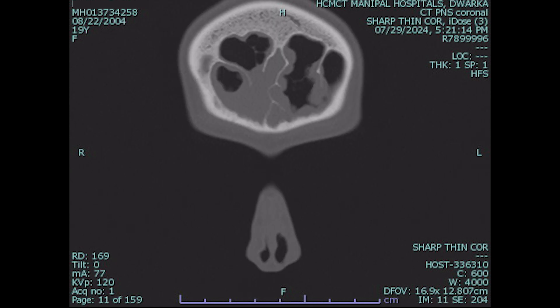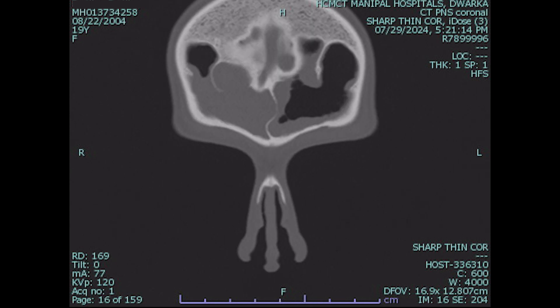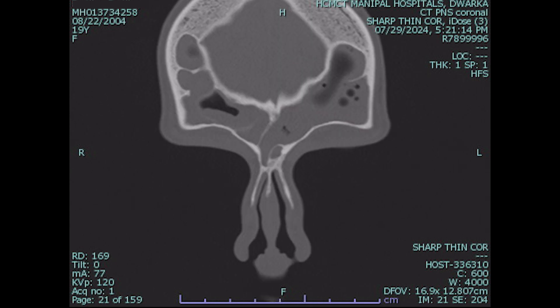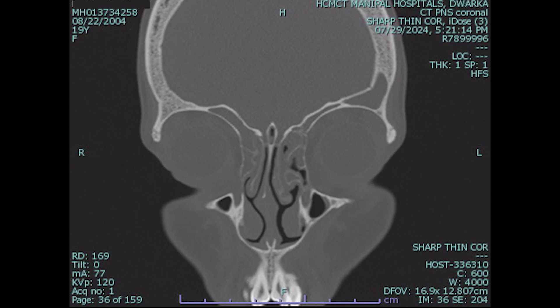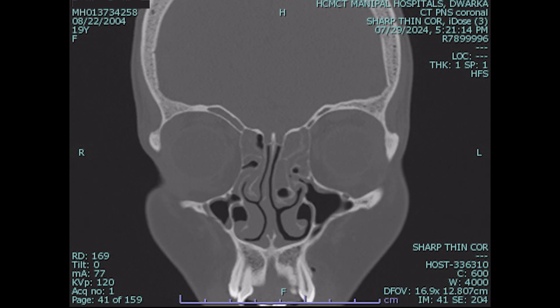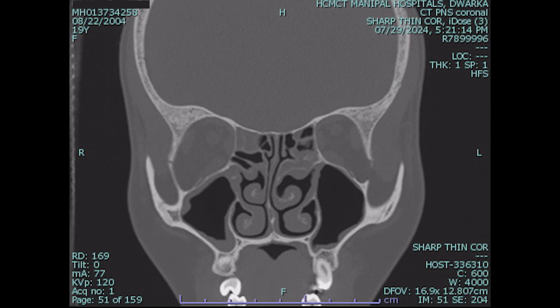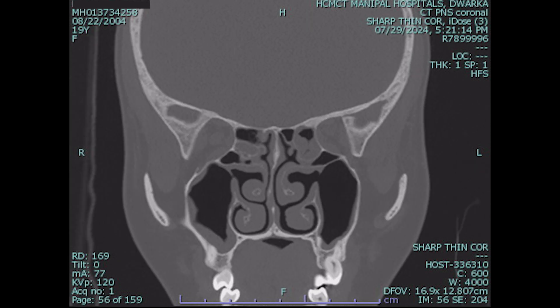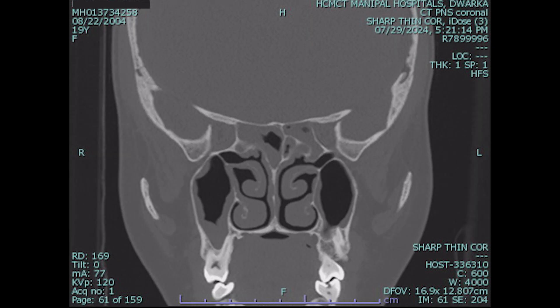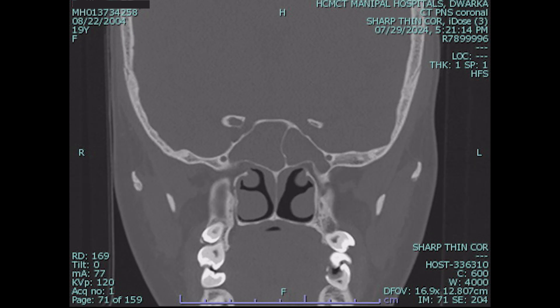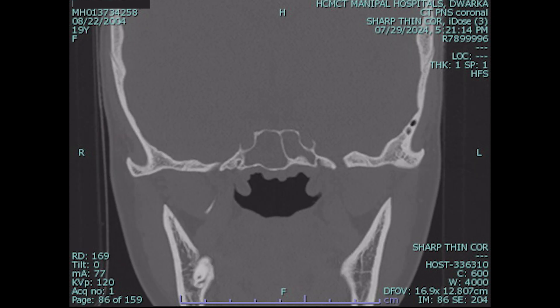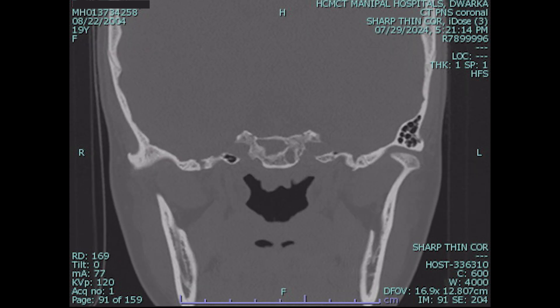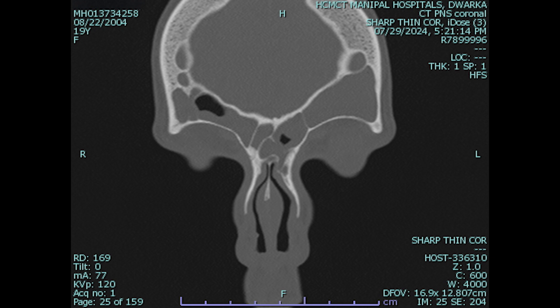This is the CT scan for a patient with bilateral pansinusitis, with gross involvement of the frontal sinuses and patchy involvement of the ethmoids as well as the sphenoid sinuses. As you can see in these moving sections, the main complaints are nasal congestion and headache.